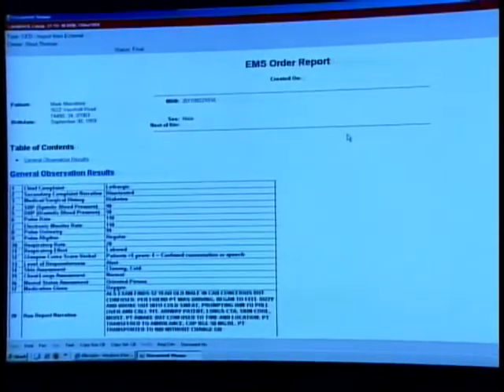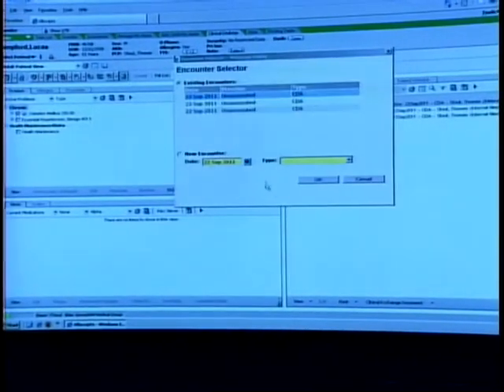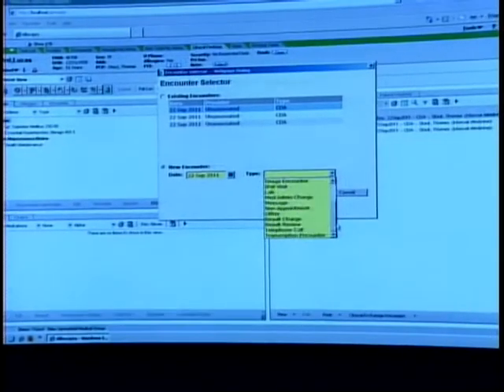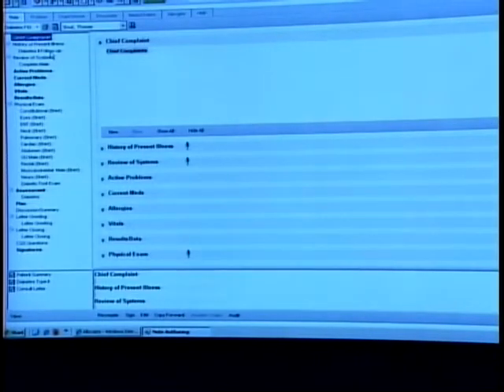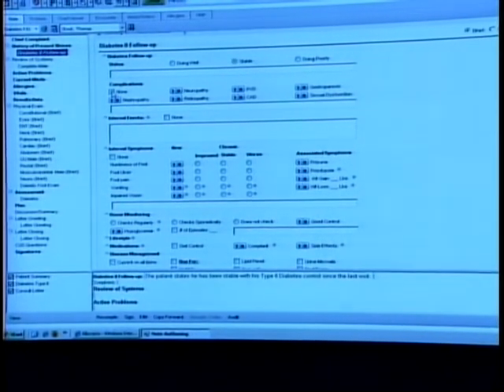So we've got all the data, vitals, diagnoses, whatever testing they may have done included in the record. What I'm now going to do, if you allow me a little time, is create a new note. I'm just going to say a non-appointment because he wasn't assigned to see me today. I'm going to say he's here for a diabetes follow-up. And again, what I'm showing you here is a real-life example of what we might do. So we'll say at this point in time that he's actually stable, he hasn't had any complications.